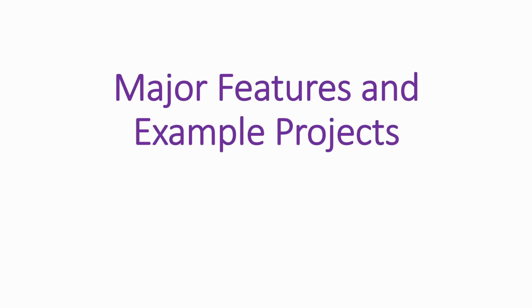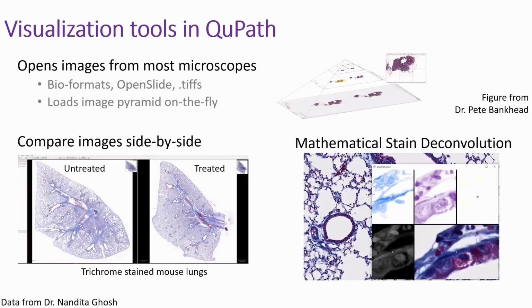I think the best way to talk about the features in QuPath is to actually go through some example projects and show you how I use the program. Frequently, people use QuPath just to look at slides. And it's really convenient because it can open images from most types of microscopes.